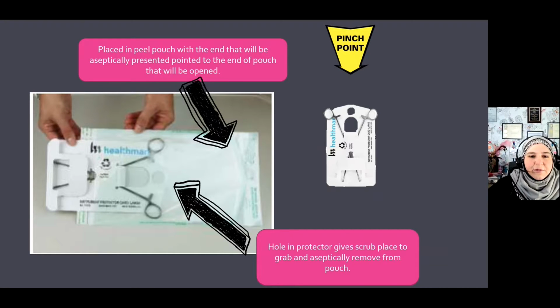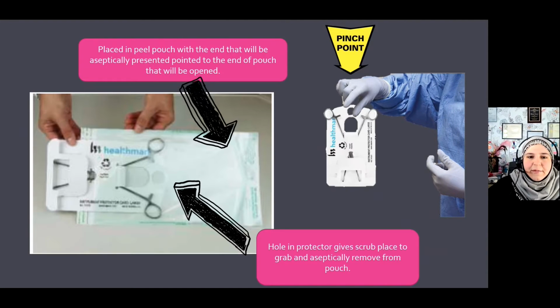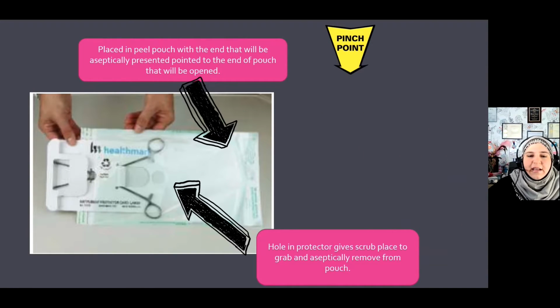So for instance, this is one of the card tip protectors that is out in the market. This one has a nice window for you to see the tip of the instrument. It actually is raised up a little bit, so curved instruments fit in this one a little bit better. And it's a nice handle when you're trying to get it out from the package, right? You just come in, grab a little hole there, and then you're able to pull it right out of the pouch. It's got a nice little finger ring there.